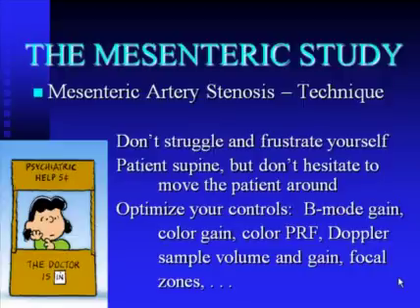From the sonographer's perspective in terms of technique, this can be a difficult examination, particularly if there is extensive bowel gas. So don't struggle and frustrate yourself. If you see one approach is not working, this is a study in which you can roll the patient around, get the patient involved, and do a number of things. So don't hesitate to move that patient around to see if that bowel gas will move out of the way. And you can use other acoustic windows, as it were, in the abdomen to achieve the data you need.